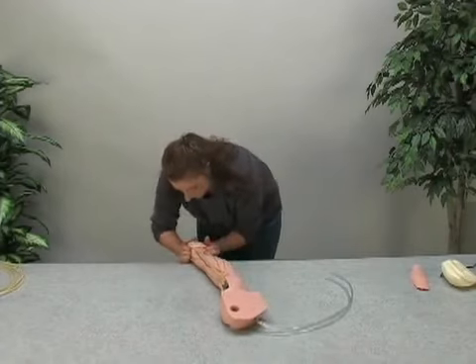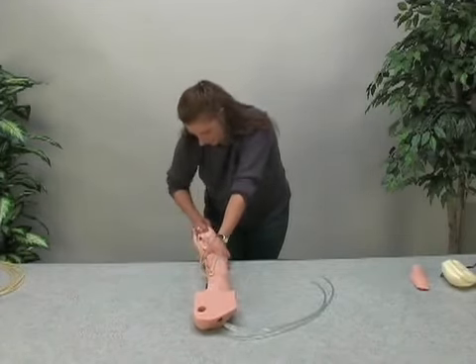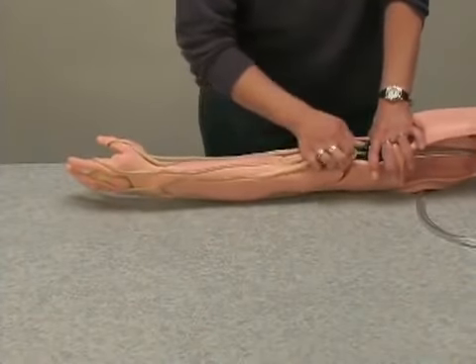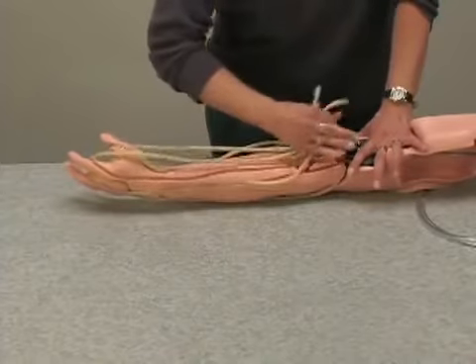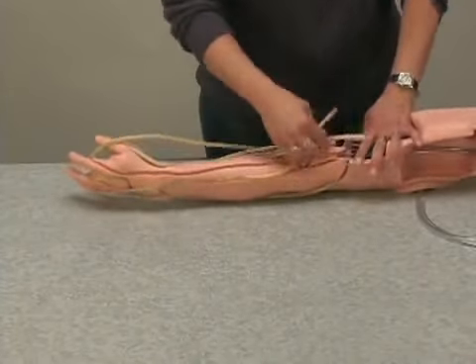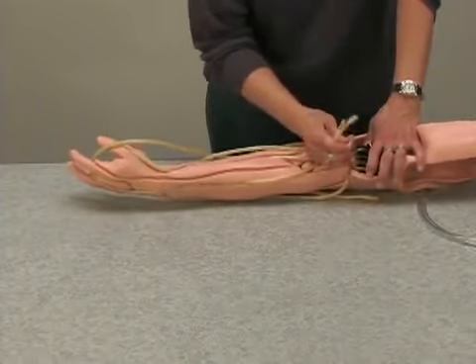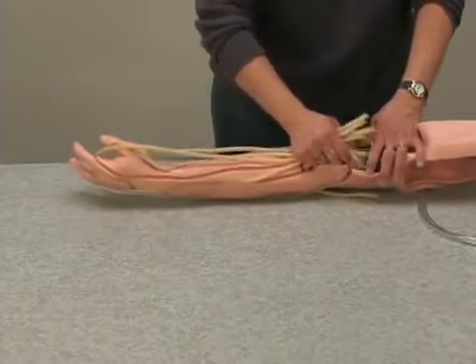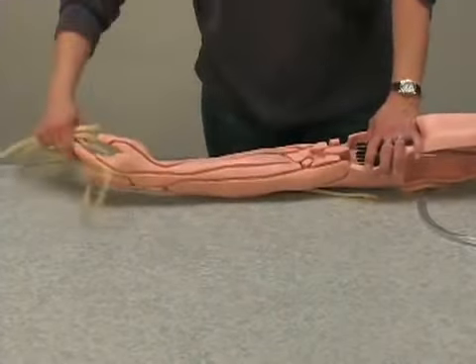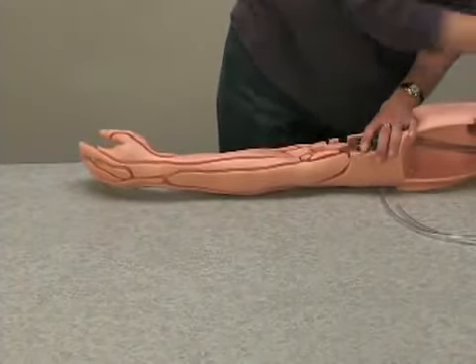Continue removing the skin by moving it over the wrist and fingers. Disconnect the used tubing from the fittings on the connector block. Then simply detach all of the veins out of the arm vein channels. You are now ready to install the replacement skin and veins.